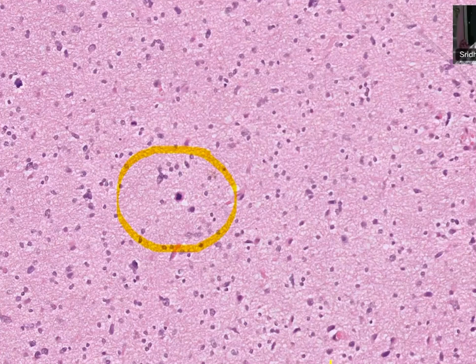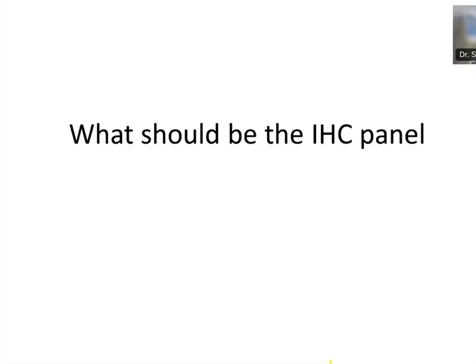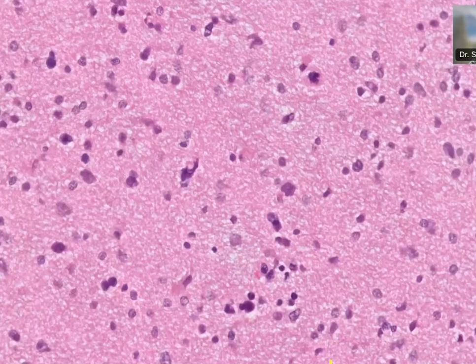So what else do you want to see now? Is there any vascular proliferation in your slides? No, sir. And is necrosis there? No, sir. Okay, not there. So at this point, if you want to summarize, how will you summarize the case?